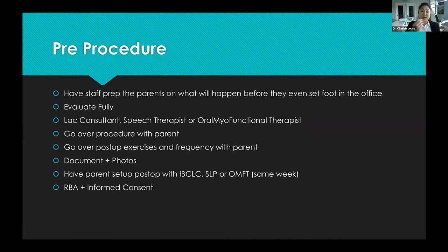And then I have them do a couple things. So first, I ask them to please, if they're able to, not breastfeed for 20 minutes prior to the procedure because I want the kid to be as hungry as possible afterward. Now, when I say I want to evaluate the breastfeeding, you don't let them fully breastfeed when you're evaluating. You let them latch and have a little bit, but then you're like, okay, that's enough. I saw what I need to see, let's do it. And then you let them fully feed afterward. I let them sit in the room and feed for as long as they need to. And then that allows them to see, oh, it's so much more comfortable, or what happened. So I ask them to please avoid that for 20 minutes prior to the procedure so the baby's really hungry.